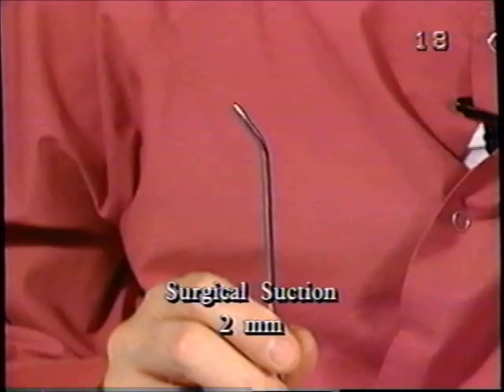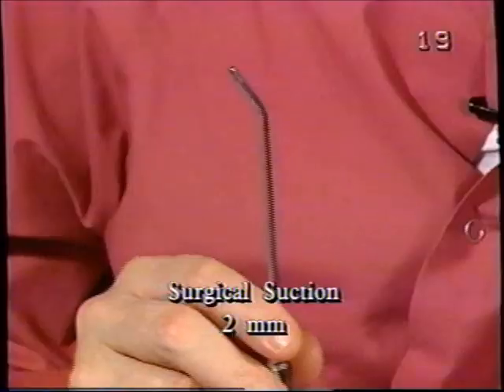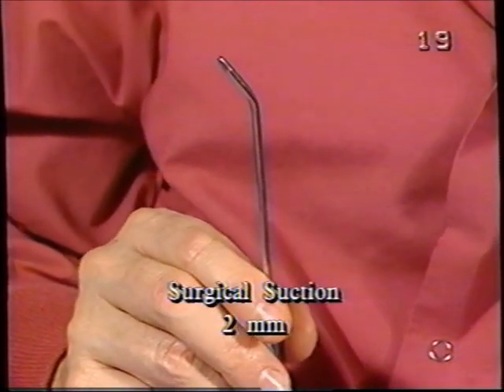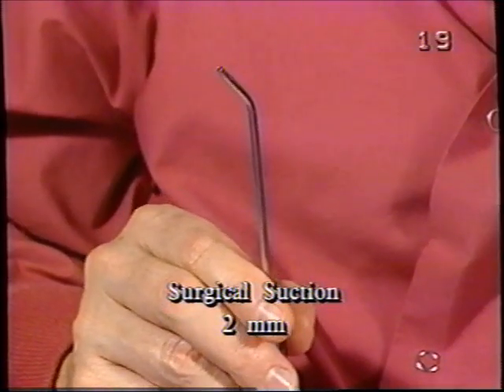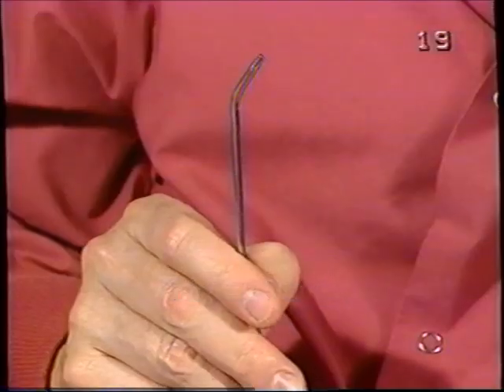Now, I showed that white suction tip earlier, and that's great. That's one we use almost all the time. But here's one that's half the outside diameter for getting up in that first bicuspid socket to see that fractured buccal root that you broke off. This one is only 2 millimeters outside diameter instead of 4.